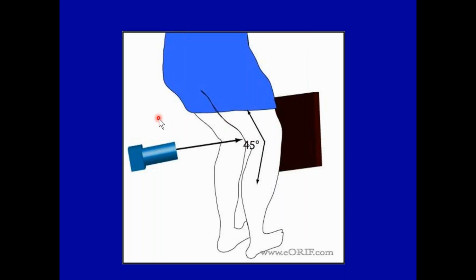How much room do you have to maneuver this? And if it's a young patient, surely you can get them in if you can't tilt your tube. So conventional X-ray, can you tilt your tube? Whether it's CR-based or DR, and if not, what positioning hint can you come up with or can you use that works?